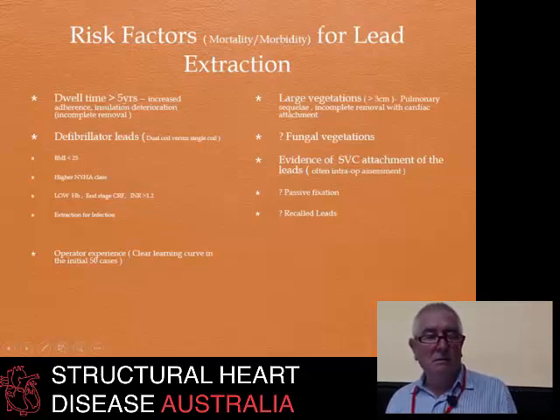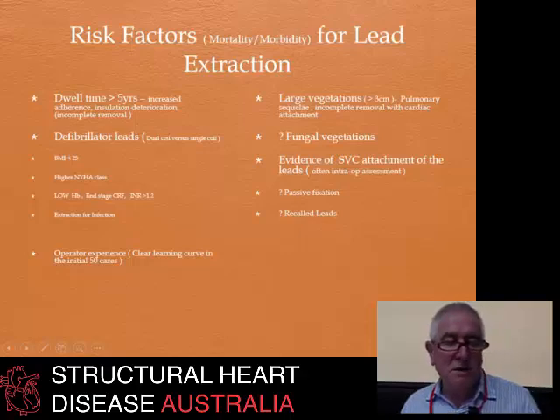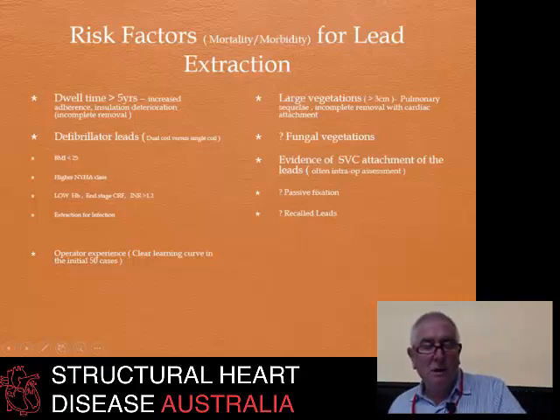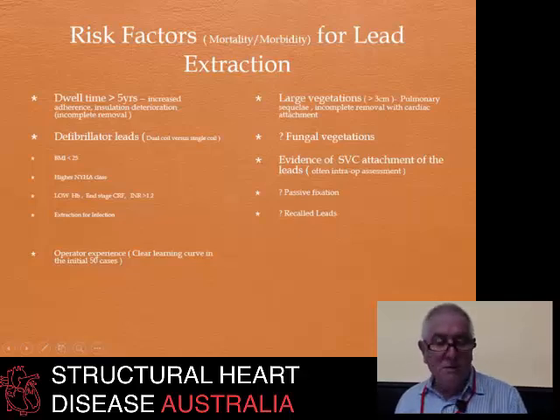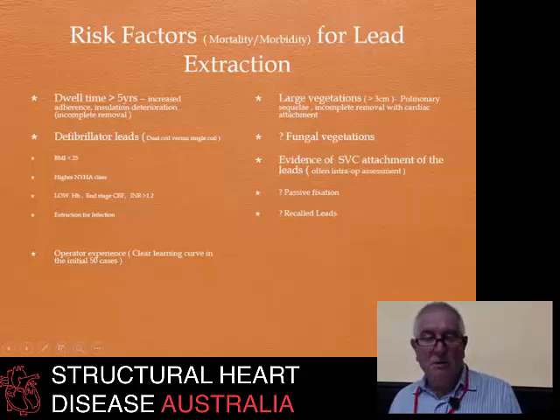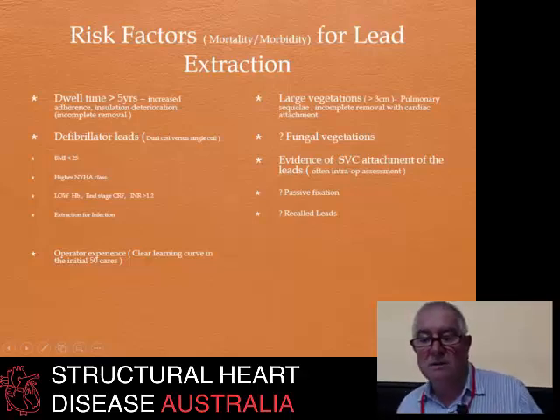Other well-known risks are BMI less than 25, higher New York Heart Association class 3 or 4, low hemoglobin, end-stage chronic renal failure, abnormal coagulopathy, and infection as an indication. And finally, operator experience. It's been demonstrated that there's certainly a major learning curve in the first 50 cases.